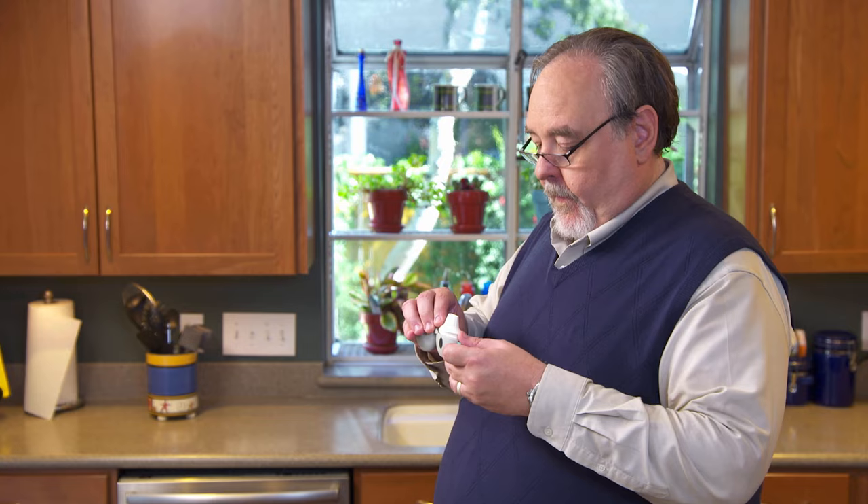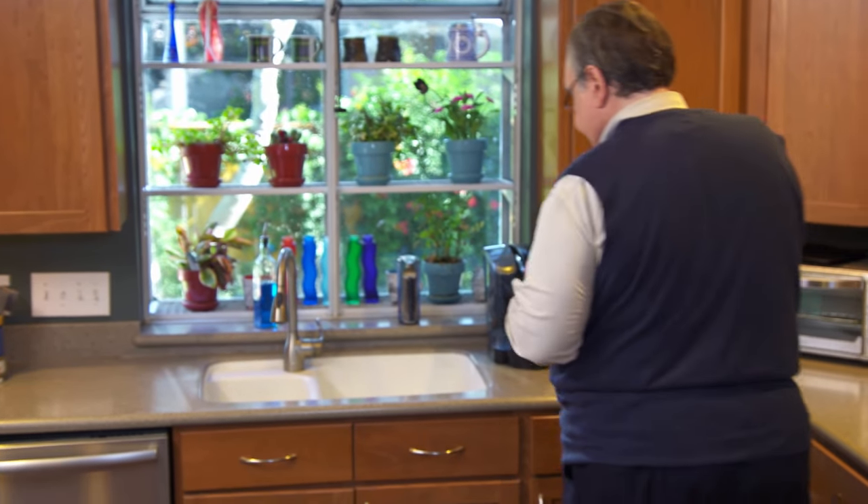Open the mouthpiece and tip out the used capsule, without touching it, into the trash can.